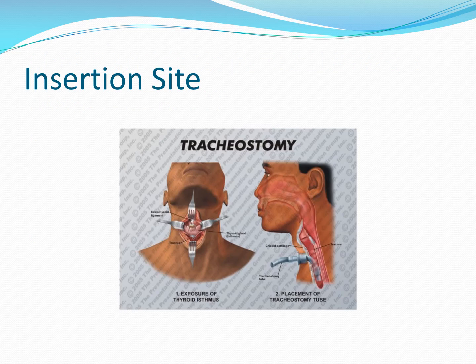This image is just to get away from the words for a minute and show you a little bit of when the method is done surgically, where it is, even some of the instrumentation, the retractors that are there to expose the site so that the 7 layers of tissue can be gotten through appropriately.